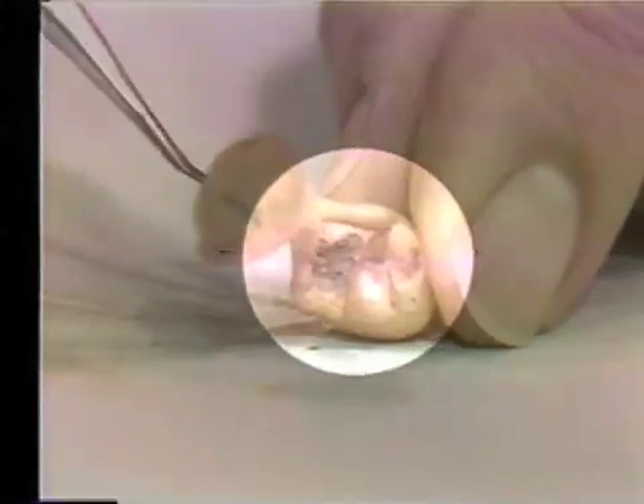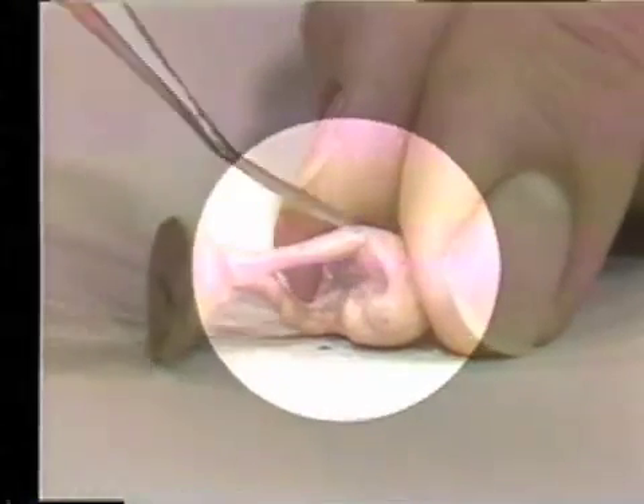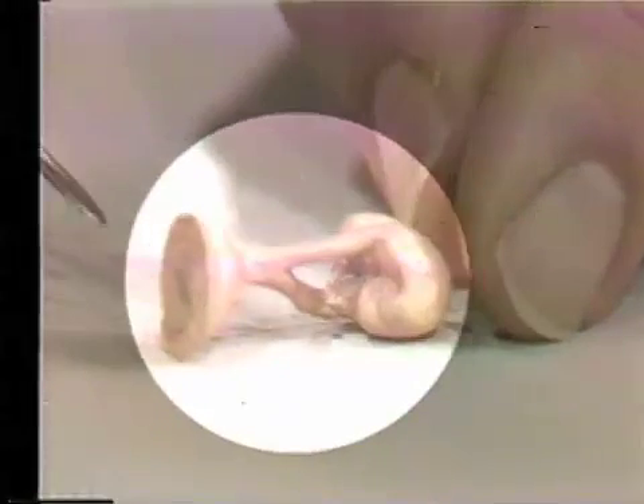One may say that the reason this happened is the distance of the sprue — in other words, that a too-long sprue was used. If a somewhat shorter sprue were used, one would accomplish better feeding.